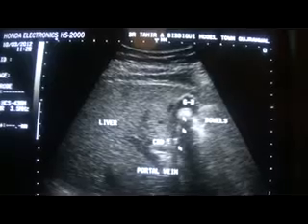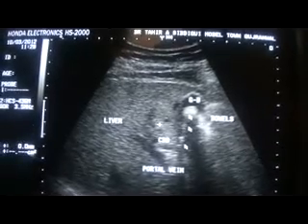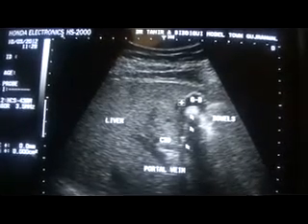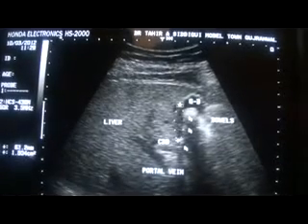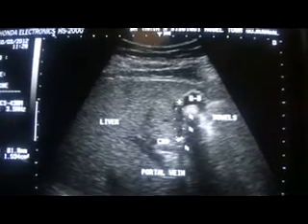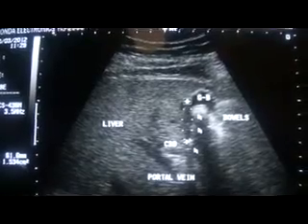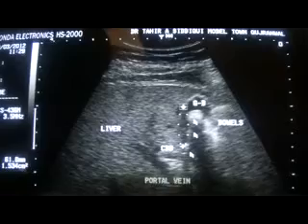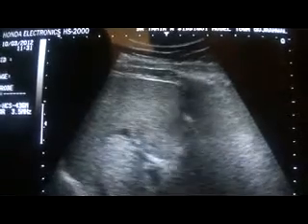Here again, if you see that the anterior wall appears muffled — by scanning from this plane and asking the patient to take a deep breath and hold it, we got this view. In this view we can see the anterior wall in total. The demarcation between the liver and the anterior wall is present. This is the difference of scanning in different planes — if we just scan in one plane and decide, you may make a mistake. So now I can say that this is a case of chronic cholecystitis with cholecystolithiasis.